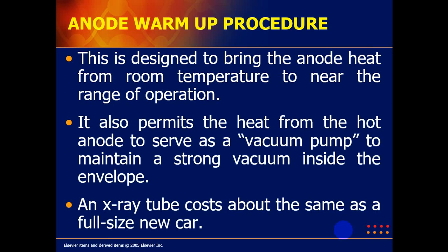That is why, every morning before the procedure, the anode should be warmed up, so that it could extend the life of the X-ray tube.